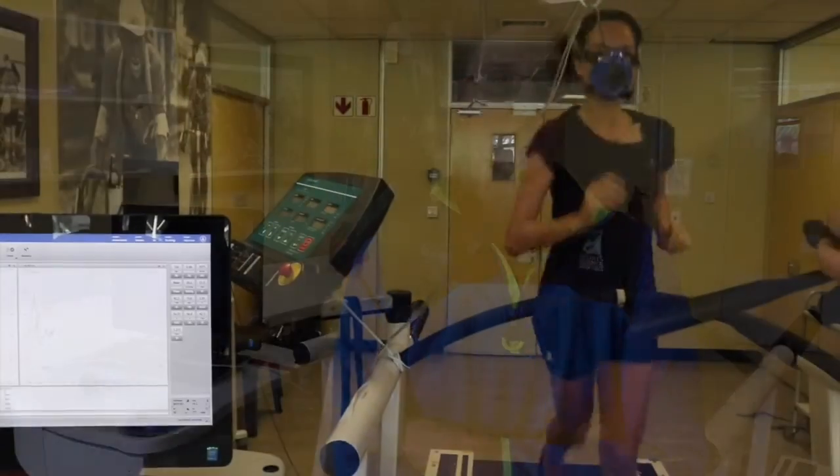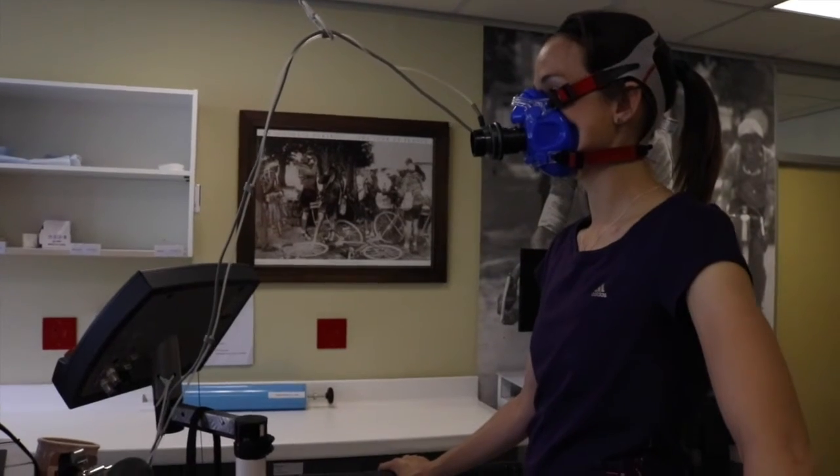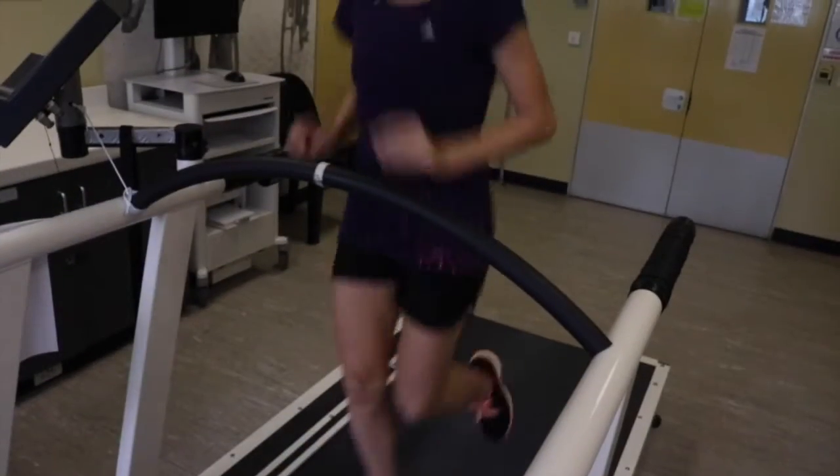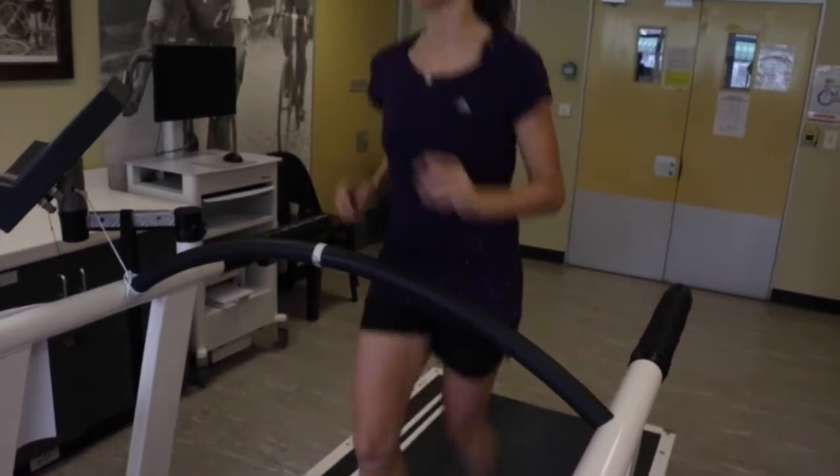I know I'm going to be put on some kind of respirator with a mask on my face, and somehow it's going to tell me what my absolute maximum is, and from there I can work out how to train. VO2 max is mainly about gathering your VO2 data — your breathing capabilities — but the most important factor is to get your training zones, so that your training can be more effective and efficient, and you get better results.